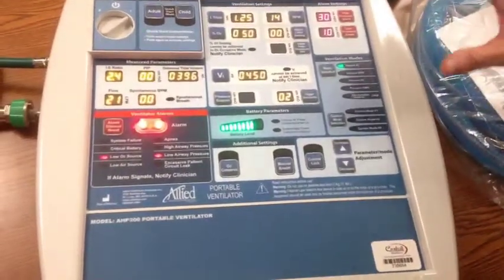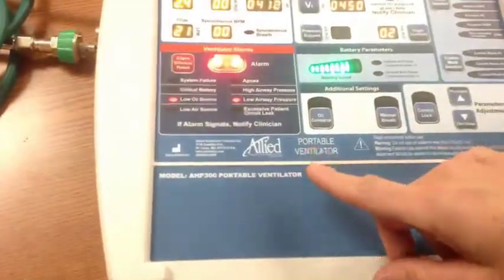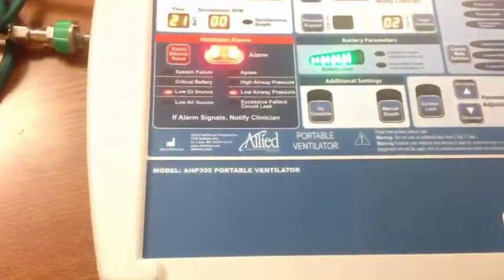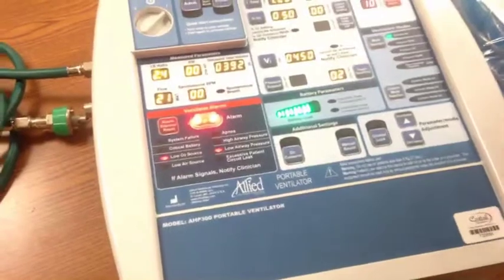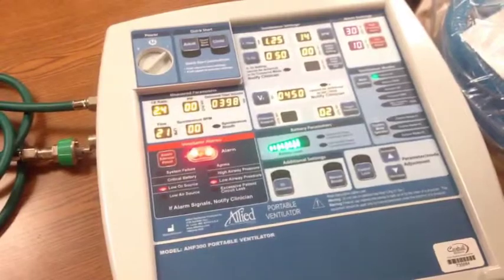If you need to silence an alarm, you would push the silence alarm button. It'll give you a silence of 2 minutes. Whatever light is highlighted will tell you what the problem is. This is reading low O2 source. It's because it's not connected into oxygen, just for purpose of demonstration, as well as a low airway pressure because it's not physically hooked into a circuit and attached to someone. Okay? But if you have any problems in the ambulance, there is a book specifically on how to operate the Allied. Have fun.